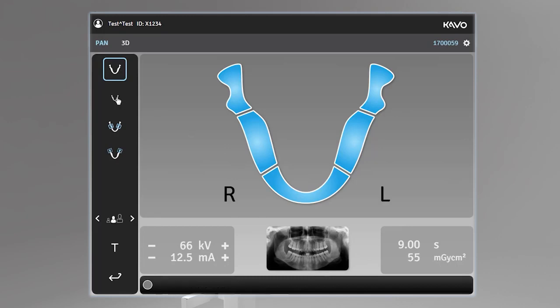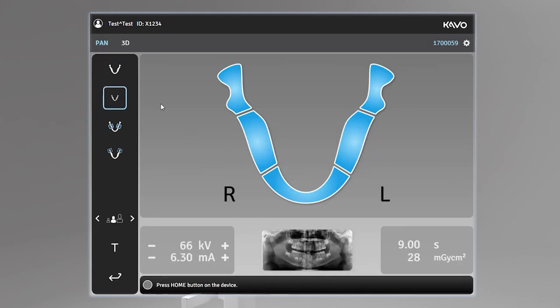The pediatric panoramic imaging program is normally used for pediatric patients. It uses less radiation dose and a smaller imaging area than a standard panoramic image. Adult patients with an exceptionally narrow jaw can also be imaged with this program.